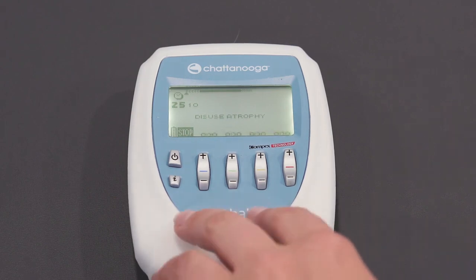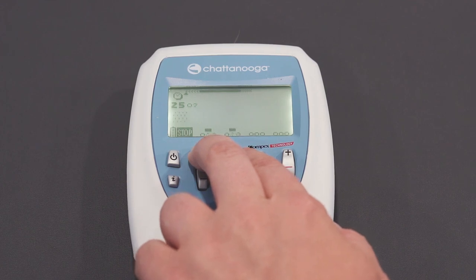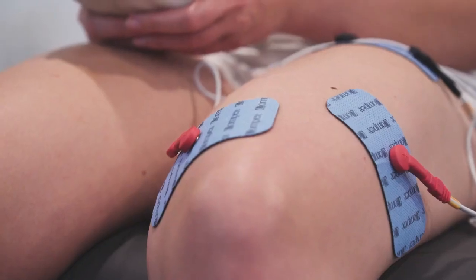On the positive signs of channel 1 and 2, turn up to a point that is comfortable. Your session will begin for 25 minutes. The intensity you can reach will get higher with each use.